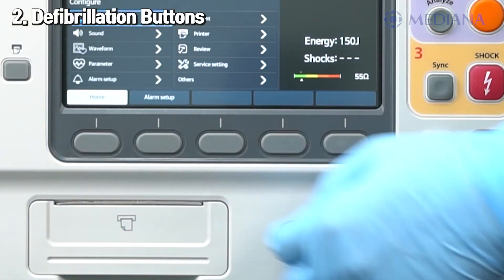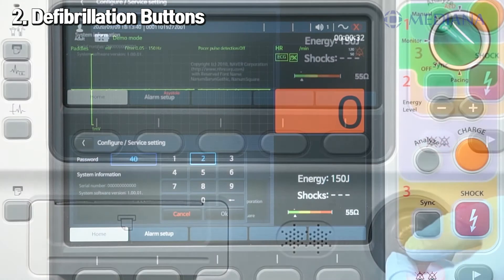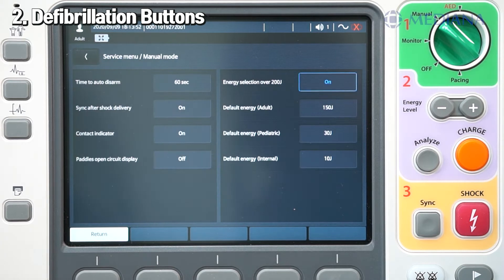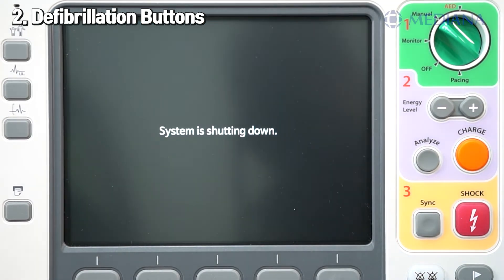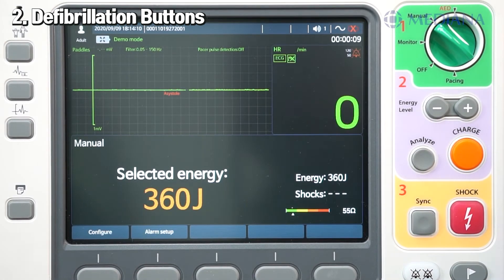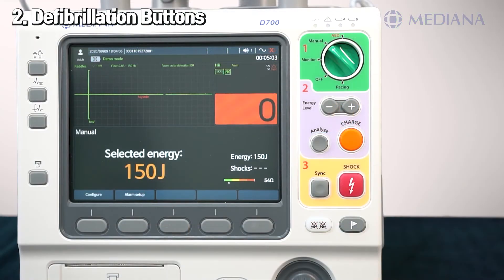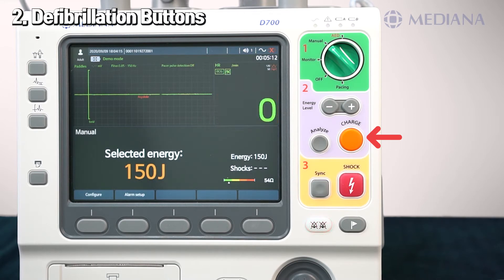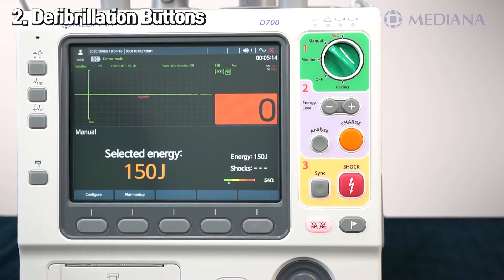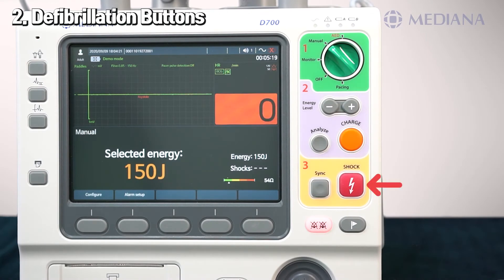To select the energy setting, press the energy level button and rotate the multi-function knob to the desired energy level. Energy choices range from 1 to 200 joules. To choose a higher value than 200 joules, enter the service menu. The energy level can be pushed up to 360 joules in service setting mode. To charge the energy, press the charge button. If using external paddles, the charge buttons on the paddle or on the front panel can be used. When charging is complete, the charge indicator on the paddle turns red.